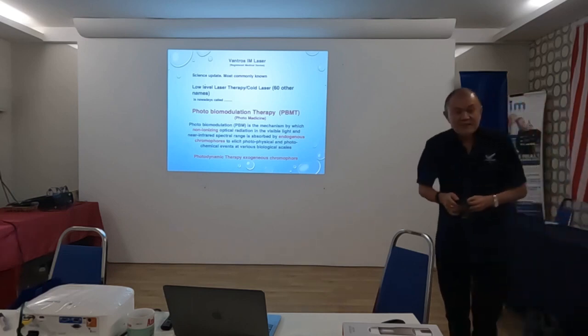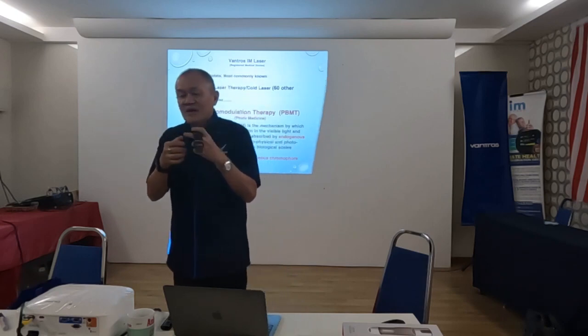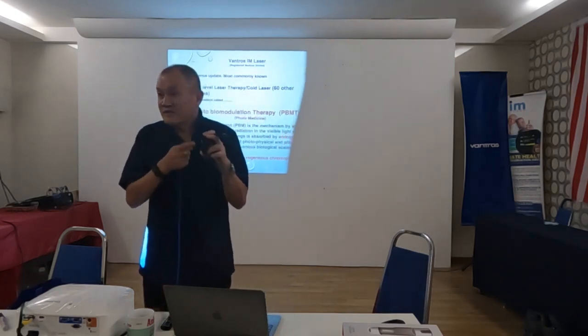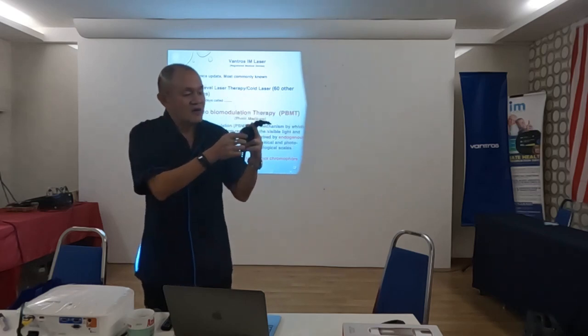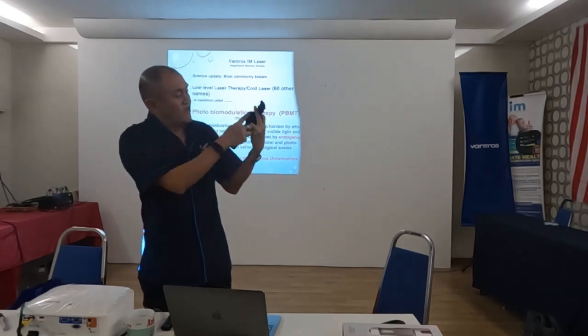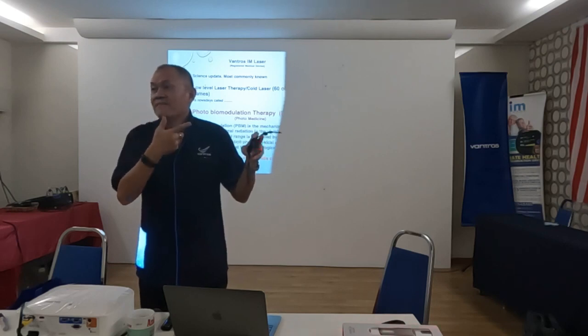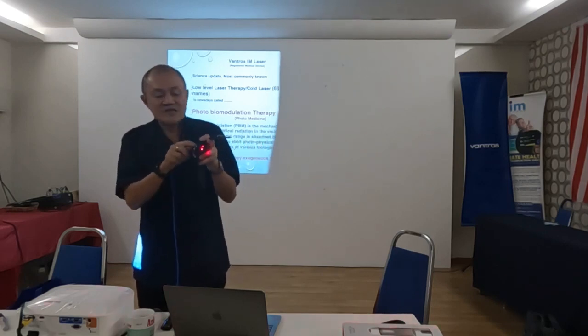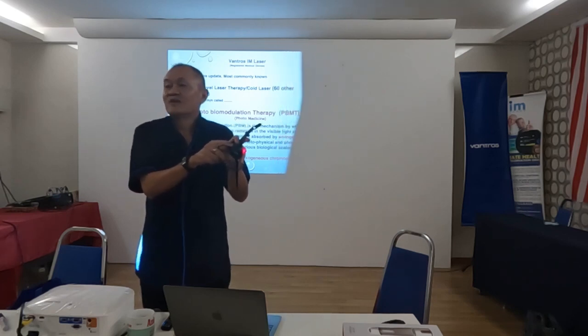I didn't realize. You actually press on. I think they showed you already that you must make sure. Actually, when it is default, all the lights are open. 4 here plus 1 here plus here. Altogether 6 lights working. If the light is not on, that means it's not working. Actually, you forgot to change the mode. Change your mode. You went to the wrong mode. The mode.